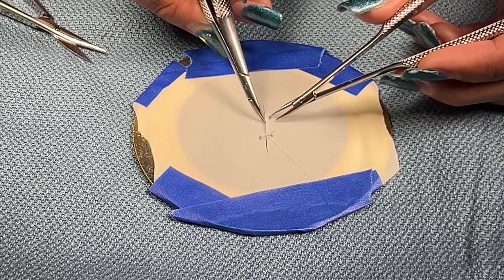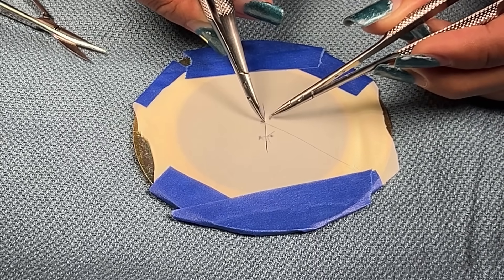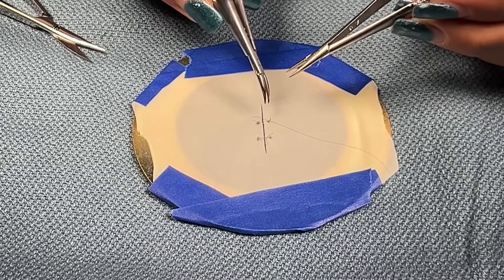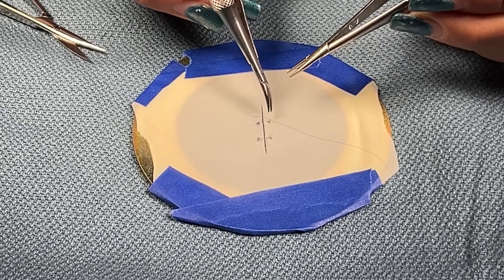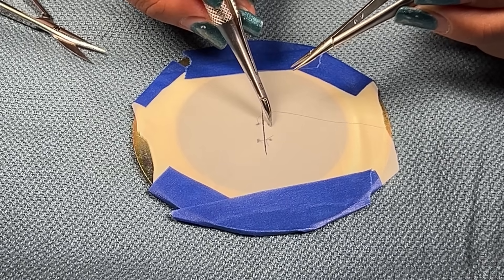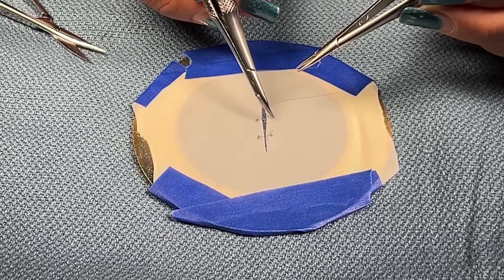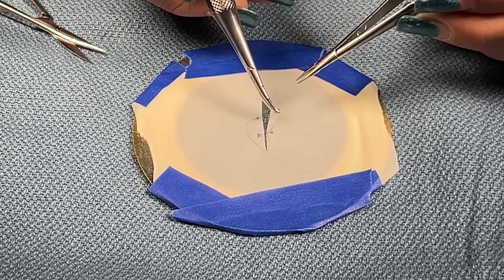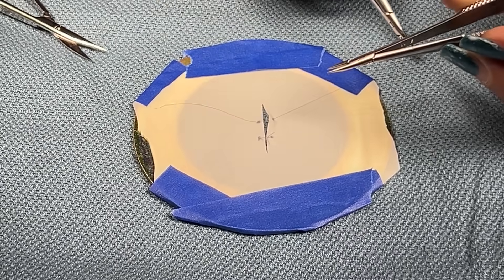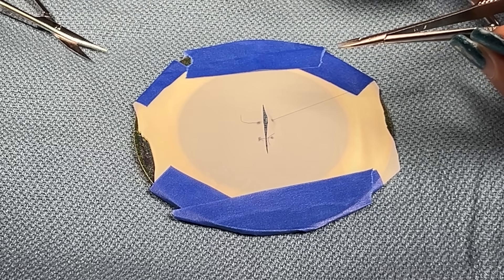I'm going to stabilize that with the forcep as I remove the driver. Using the driver, I'm going to grab the tip of the needle and rotate the needle out, and pull it until you have a little of the suture on the tail end.